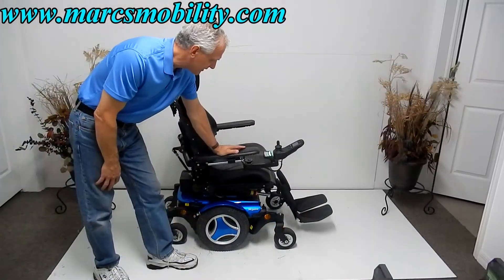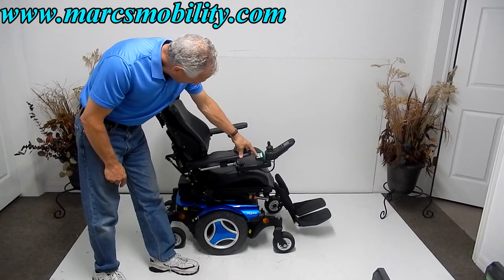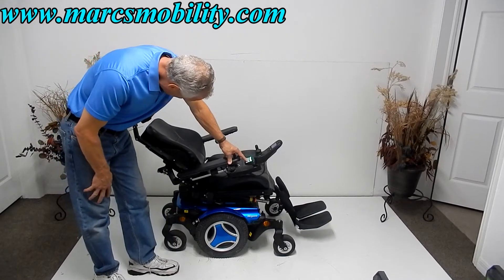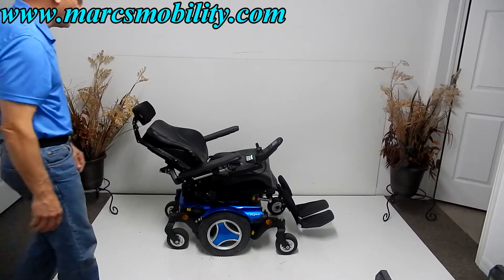This chair also has electric recline. To do the recline, you just hit the button over here and your back will go back. So this is your electric recline — very quiet. So this is a partial recline; this is not a full recline.